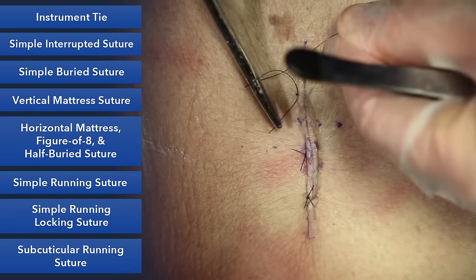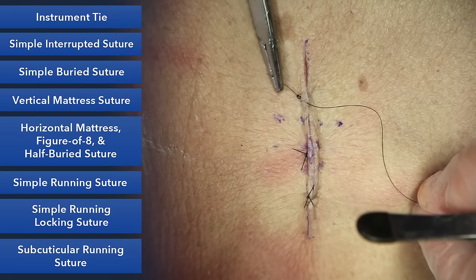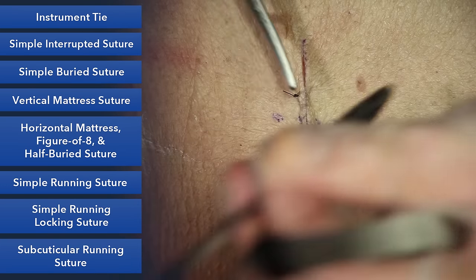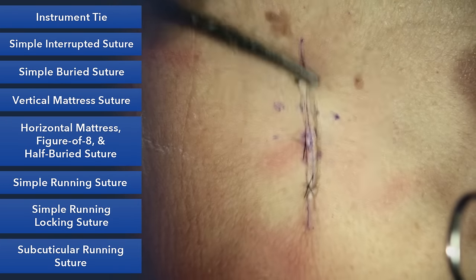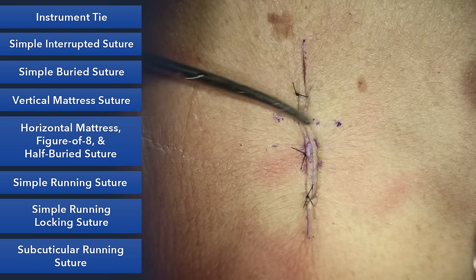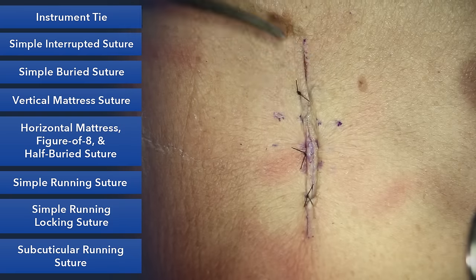You'll see we'll do this at times when we have a hair-bearing area and a non-hair-bearing area, and we want to hide the suture marks. Or if it's a very end or tip of a flap, and we're afraid that putting sutures in the tip is going to interrupt the blood supply. So our three variants of a horizontal: the straight horizontal mattress, the figure of eight, and the half-buried horizontal mattress.